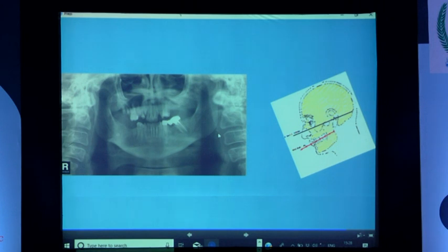Now when you lift the chin, that's what happens. Now if you put the chin down, this is what happens. You have a downward V. That was the upward V, this is the downward V, right? And then again there's a lot of loss of focus in the anterior region of the teeth. You'll not be able to decipher, and then you'll not be able to see anything.